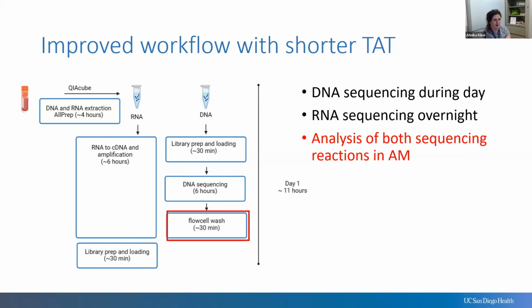Is DNA from these rare pathogens not included in the BioFire expected to be at detectable levels in BAL during true infection? That is a good question, Brady.